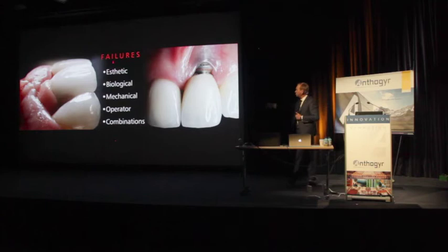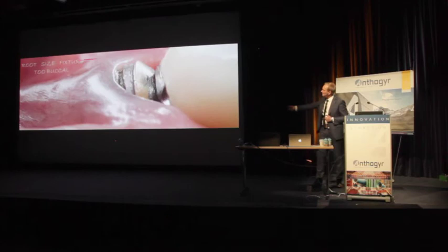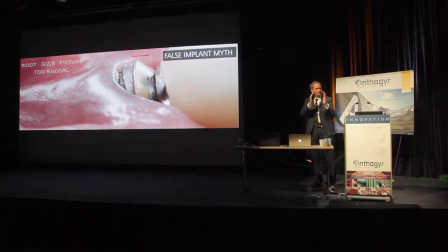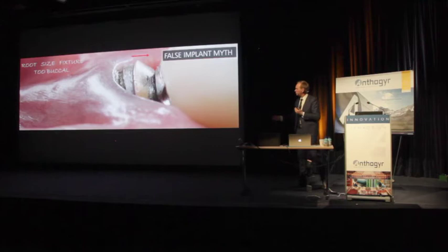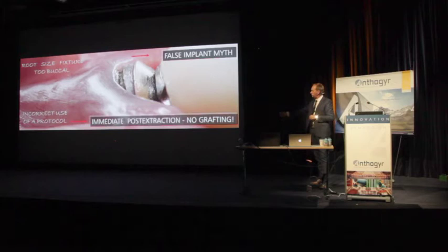Look at this one. 1 year after placement, a problem, the buccal bone is gone. It's a very big implant. That's also something wrong. We cannot copy one-to-one the root with a big fixture and place it against the socket wall. This is a false implant myth. And also, it was an incorrect use of a protocol in this case, because they placed this implant right away after an extraction without doing any type of grafting. So we cannot preserve what there is.